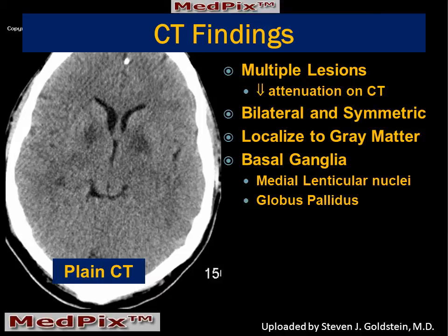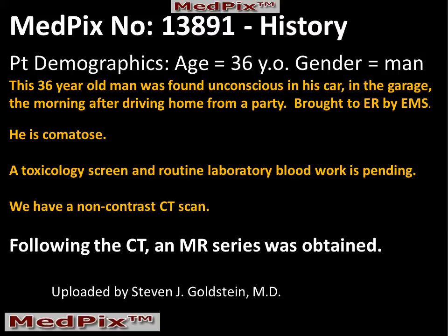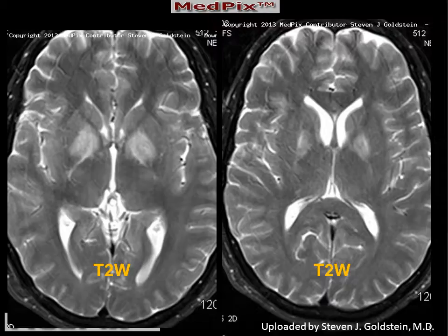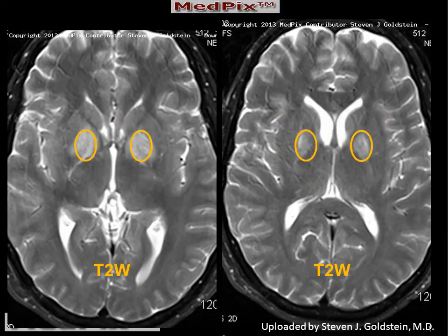So this patient has multiple lesions of decreased attenuation on the CT. They're bilateral and symmetric, localized to the gray matter of the basal ganglia, and most importantly, they're localized to the globus pallidus. Following the CT, an MR series was also obtained. It demonstrates corresponding abnormalities involving the medial portion of the lenticular nucleus, the area of the globus pallidus.